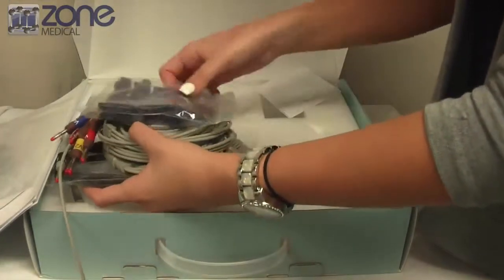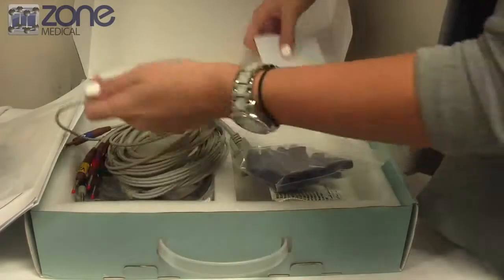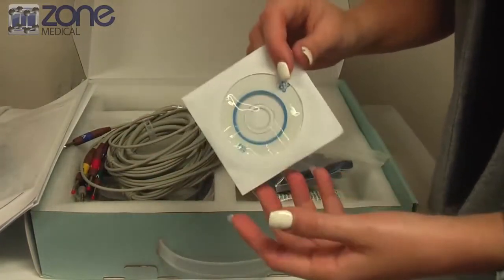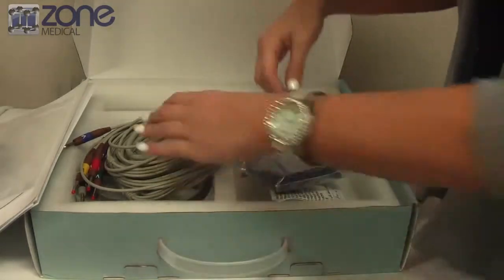Lastly, in the unboxing, you'll also find the software disk. This is to put into your computer to actually install the software to be able to use the ECG Mac.